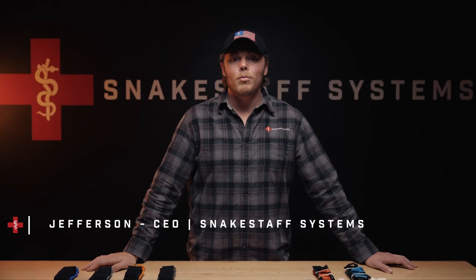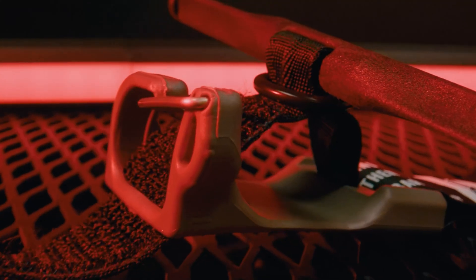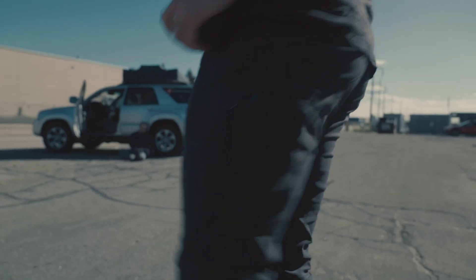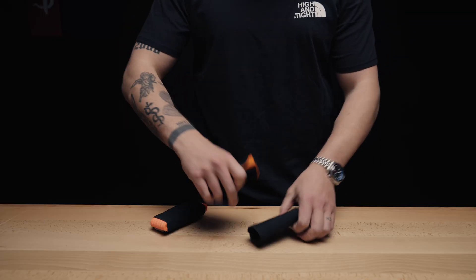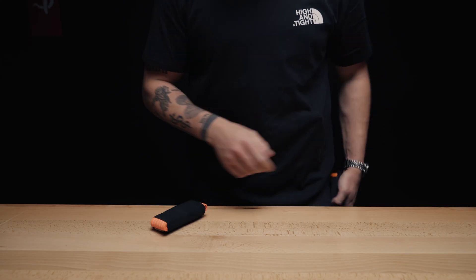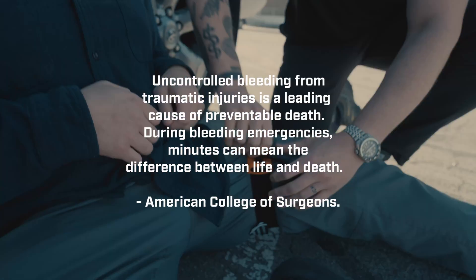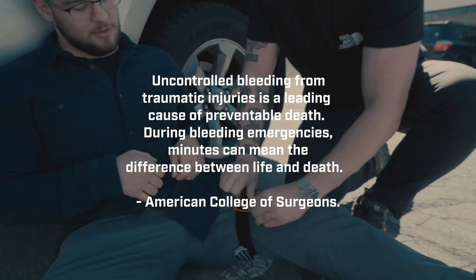Tourniquets save lives. That's not marketing, that's fact. But the way we use them and the way they're built has changed over centuries. We designed ours with one goal: to make sure you actually carry one. Because a tourniquet in your pocket beats the one left at home on the nightstand or in your glove compartment. The American College of Surgeons makes this urgent — uncontrolled bleeding is a leading cause of preventable death, and empowering people with simple tools and training saves lives.